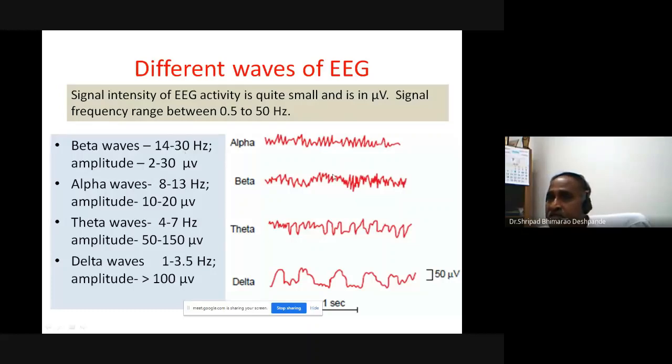When this person suddenly changes, so that he is now disturbed, maybe a light is on, he opens his eyes. When he opens the eyes, the alpha wave pattern disappears, and smaller waves come up with higher frequency.